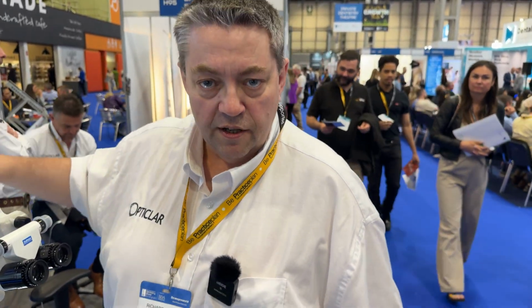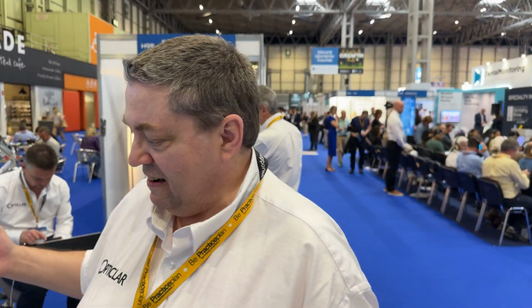It's embedded. And the video camera being embedded is so important because it doesn't affect the balance of your microscope. If you have a beam splitter and a camera on one side, it really affects your balance, which means you end up having to stiffen up all the joints. Being central, it protects the camera, and also it means that the image you see is the image you're seeing down the binoculars. Sometimes I've seen ones where they connect the camera at the side, and the image you're seeing on the camera is slightly off the one down the binoculars. Well, that's the problem I have with the scope I've got now. There's a little ring where you adjust the camera, but even then, it's not the same image.